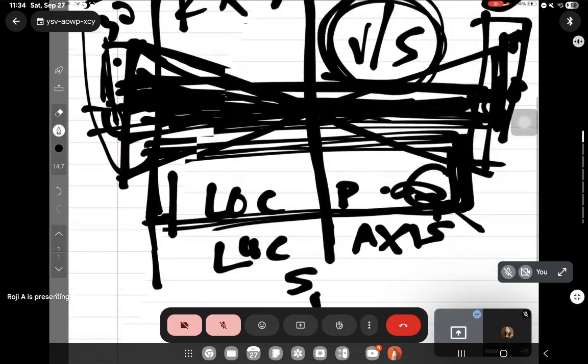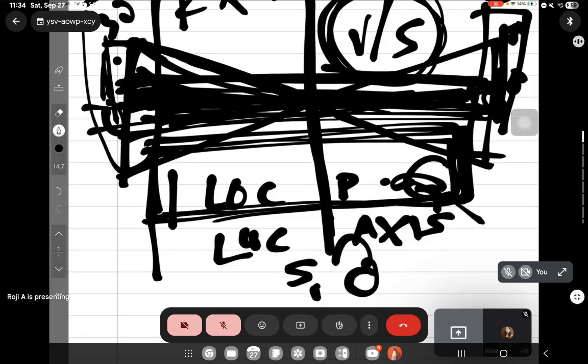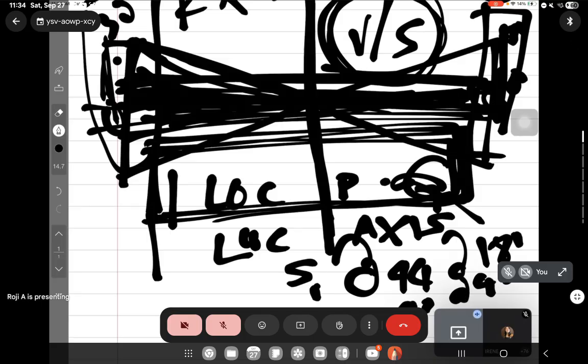When you use K readings, for example, I have 44 at 180 and 43 at 90. Where is it flattest? At 90 po. Flattest at 90? Ay, at 180 po.